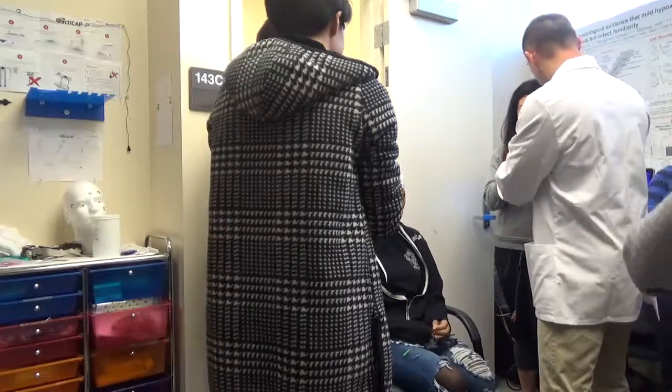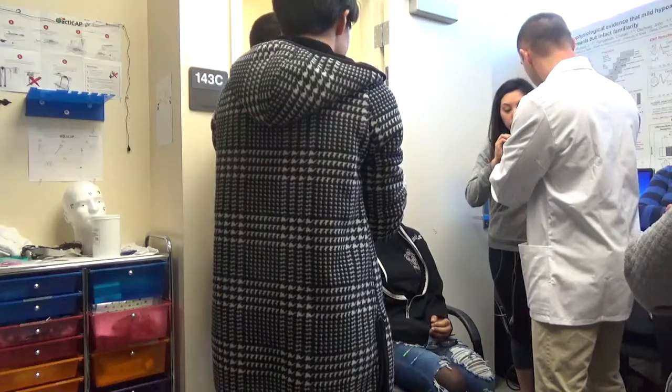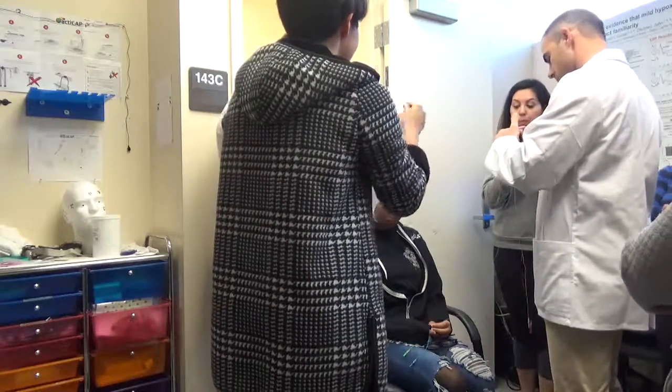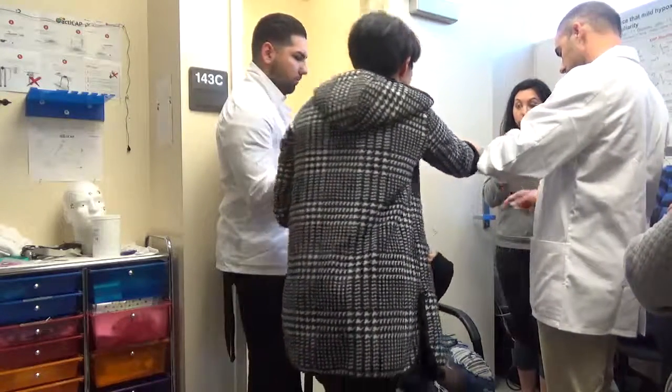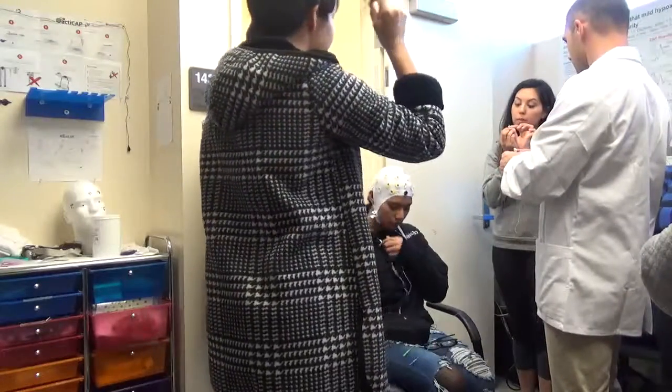Just a little bit of energy. Just line up the holes. Got it? But try not to put the tab directly in line with the wire, so when you take it off, it's easier and you don't pull the wire. Okay.